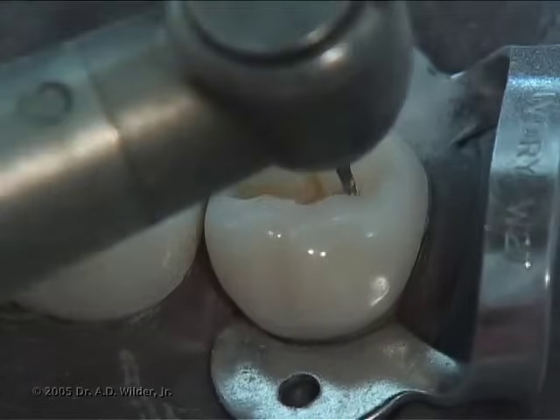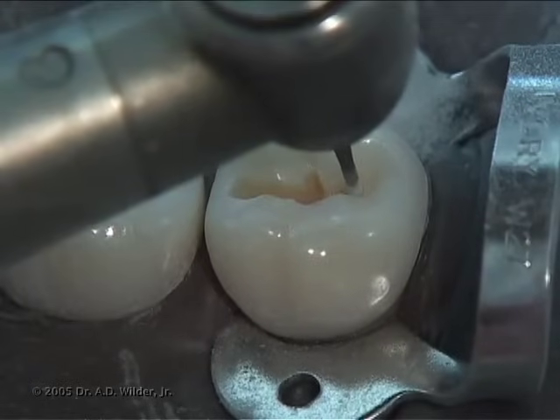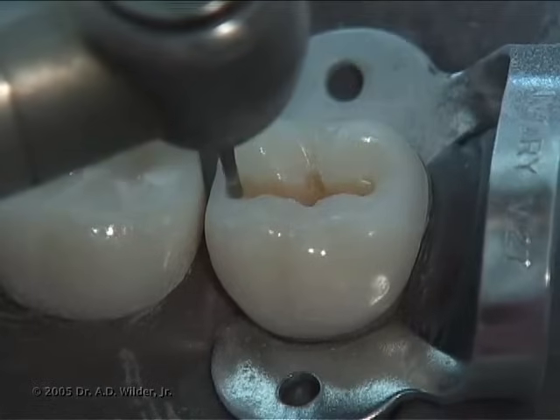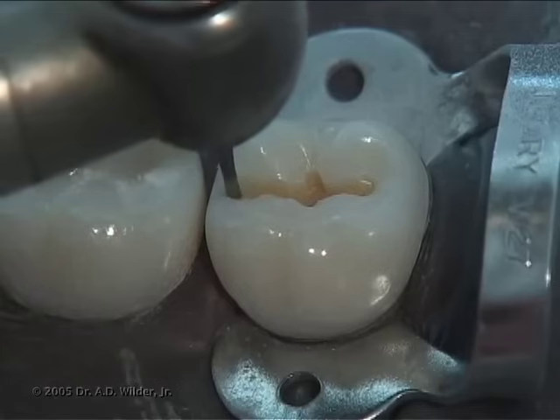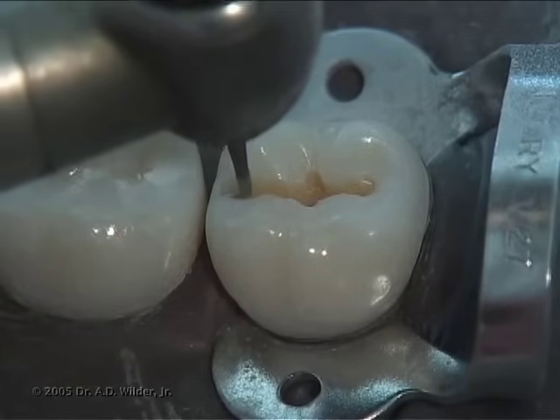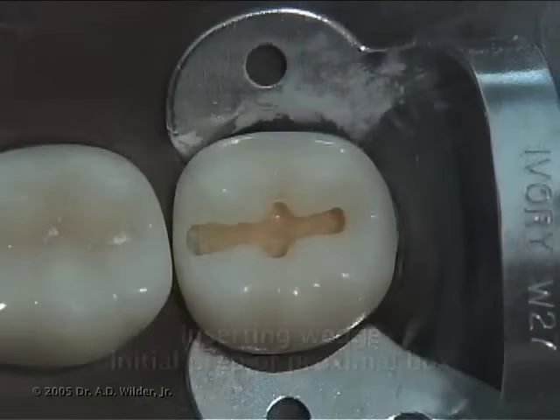Extend mesial and distal and buccal and lingual along the natural grooves of the tooth to incorporate the extent of disease until you reach sound tooth structure. After completing the occlusal step, slowly approach the proximal surface that's affected by interproximal decay.